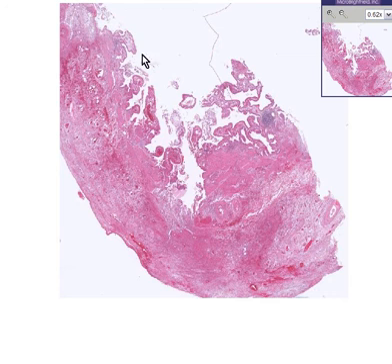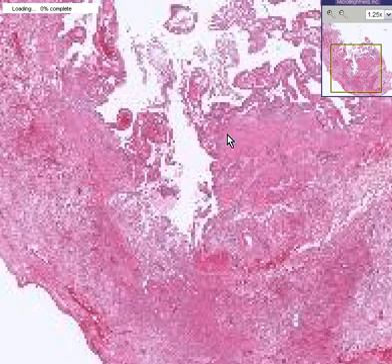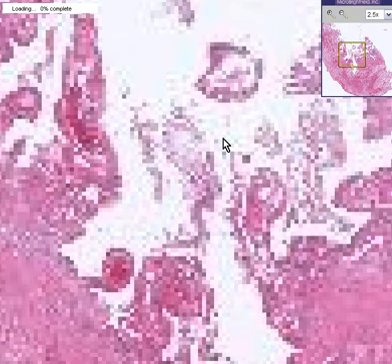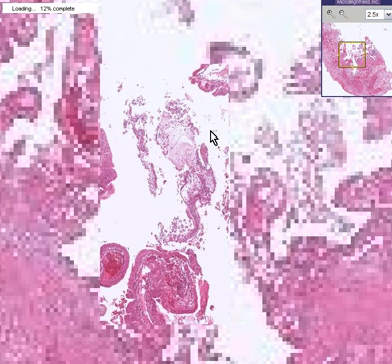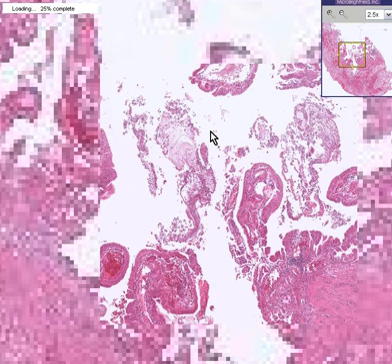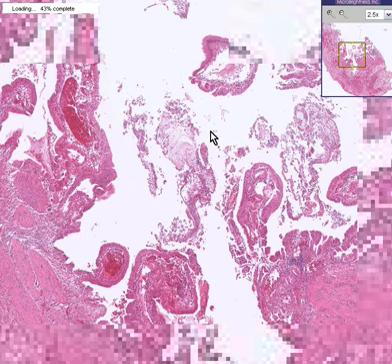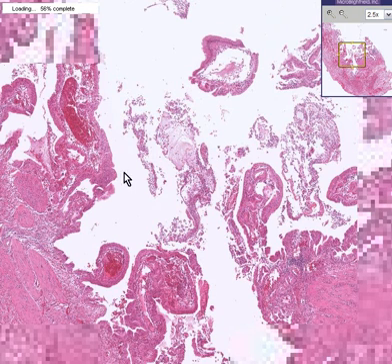So let's look. Here is obviously the lumen of the organ. Here's a thickened wall, and here's the outer, perhaps peritoneal surface. And let's just kind of describe it. And we might as well start from the inside. Well, the first thing that you could see is that nice little sort of papillary array of columnar cells is considerably disrupted.